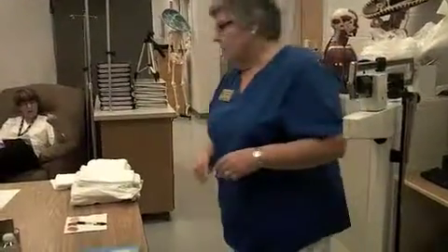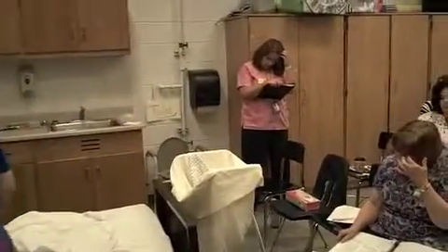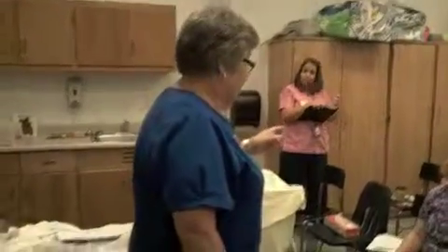Now, let me see. I wrote that down. I washed my hands. I wrote that down. She's okay. She's got her call bell, and I'm done with that skill. Okay. Other than the washing of the hands, that was bad. I did it again. Did I leave anything out?